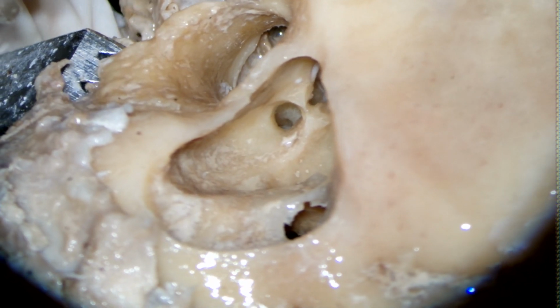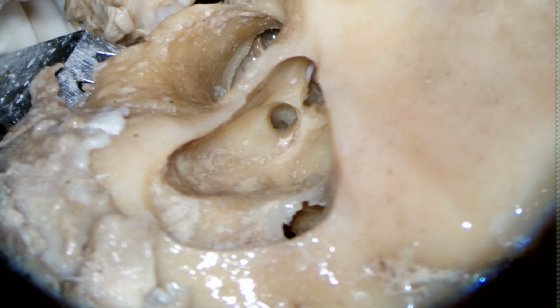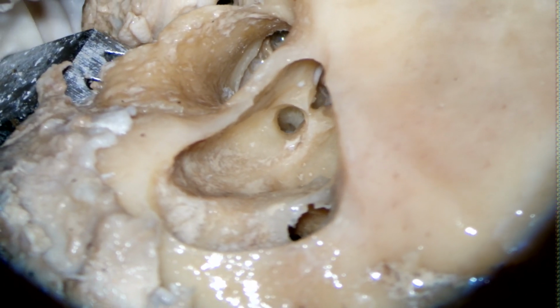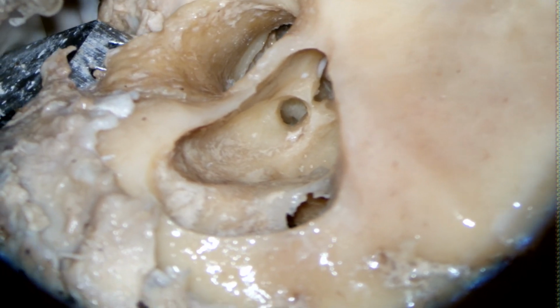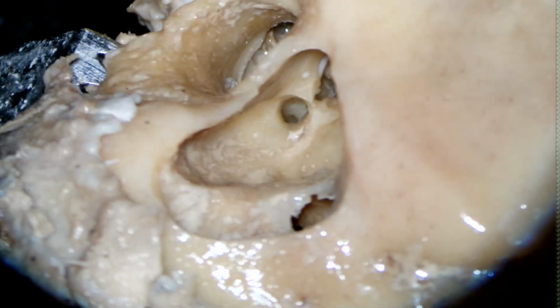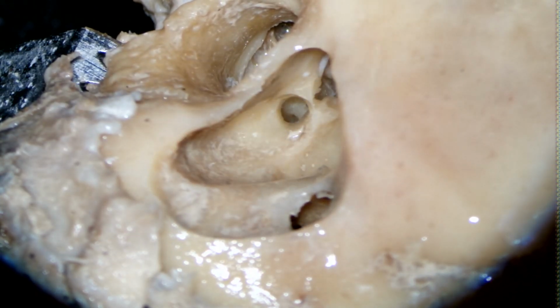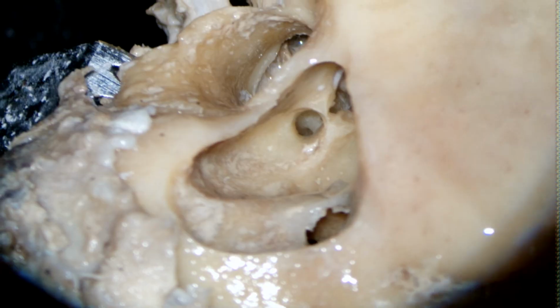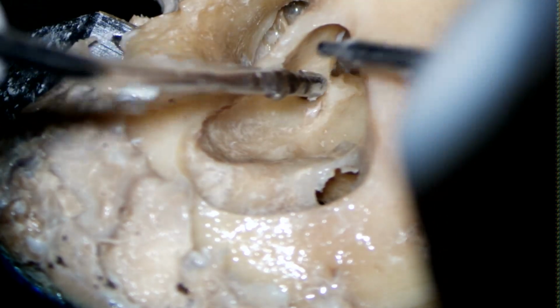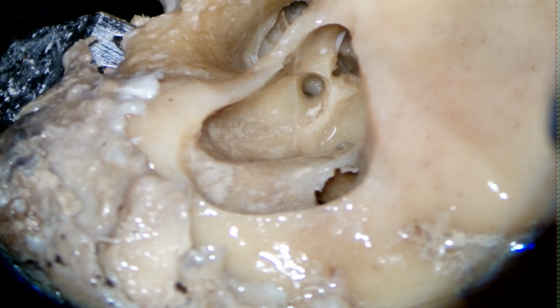So when you are trying to do a cochlear implant, you might have to position the patient's head, right? Also, if you are having a problem identifying the round window niche, you can use an endoscope also, right?